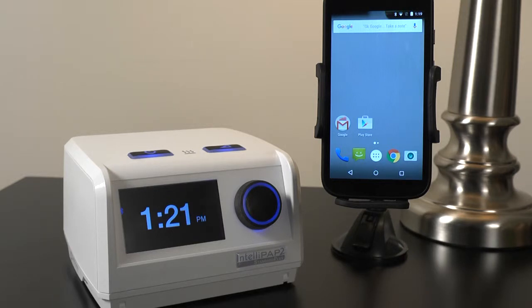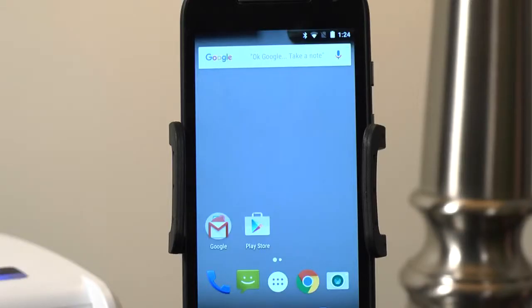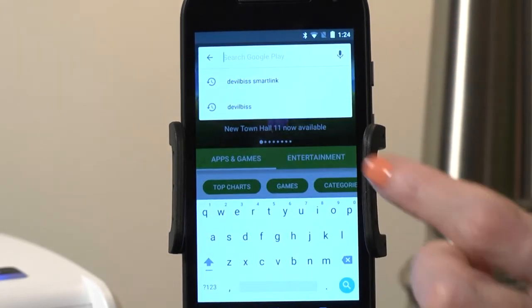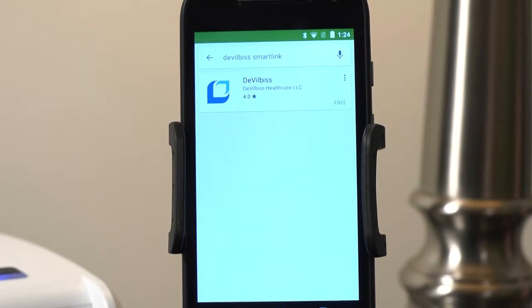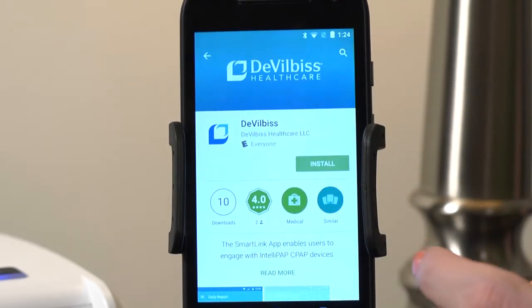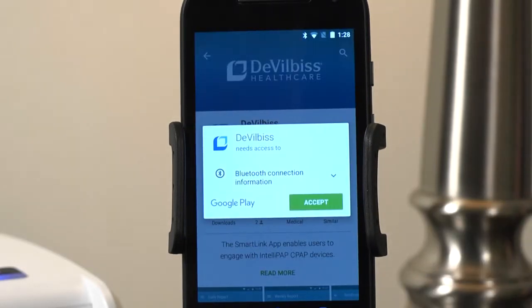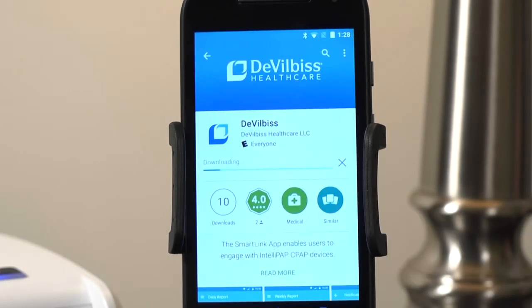To connect the IntelliPAP2 to your Android device and begin collecting your CPAP data, first open the Google Play Store on your Android device and download the DeVilbiss SmartLink app by searching for DeVilbiss SmartLink. Tap Install and then Accept to begin installing the app on your device.